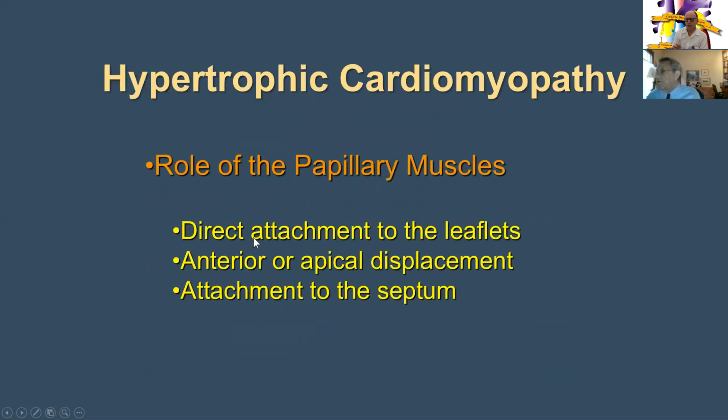Now, the papillary muscles may be directly attached to the leaflets. There may be anterior or apical displacement, or they may actually be attached directly to the septum.